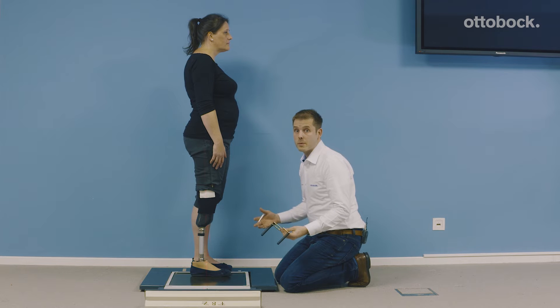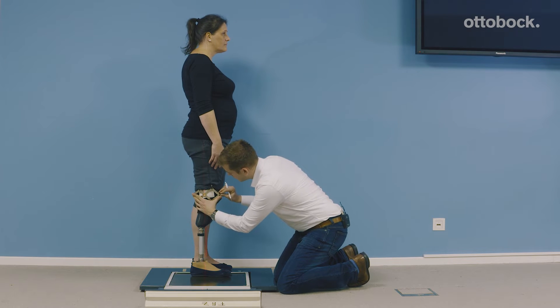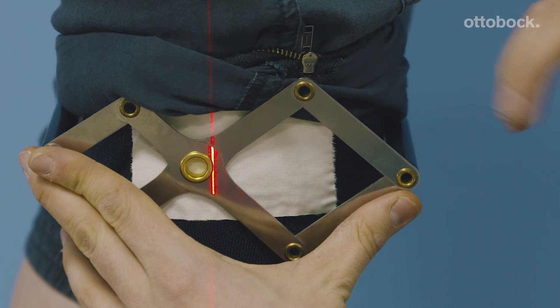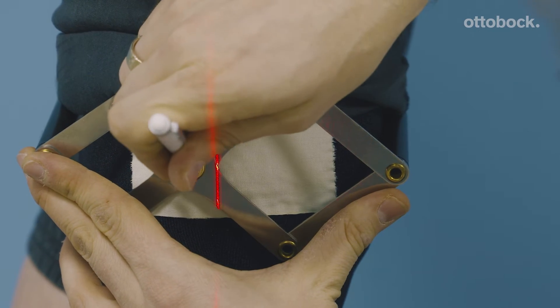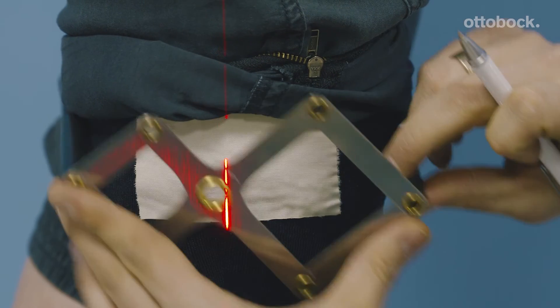I want to speak a bit more about dynamic alignment. Let's first have a look at where the knee joint is positioned. It's really important that we load the knee in a physiologic way. Therefore, we mark the knee rotation point 15 millimeters in front of the knee axis.